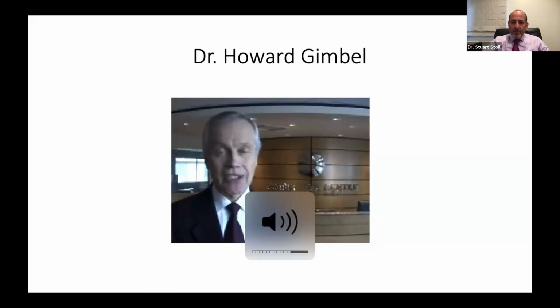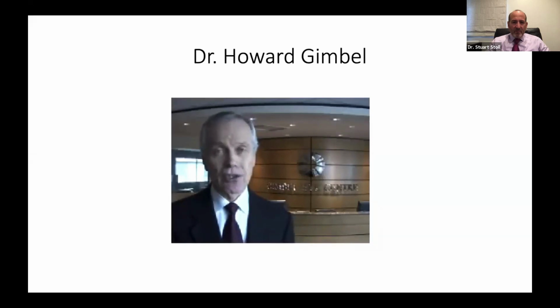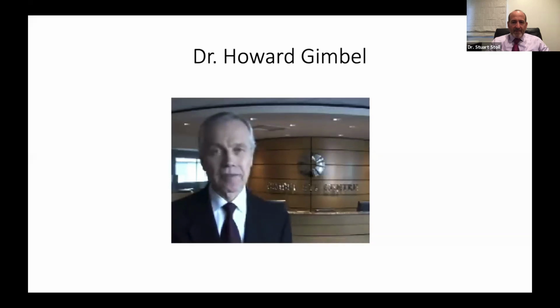Hello, I'm Dr. Howard Gimbel. I'd like to speak to you about an important teaching aid to help master the technique of continuous curvilinear capsulorhexis. I'm pleased that the CCC technique has become integral to modern cataract surgery. The teaching model, developed by Dr. Stoll and his colleagues, is a simple yet effective method to help master this crucial step in cataract surgery. I would encourage all of you that desire greater proficiency in the OR to utilize this tool to become more confident and effective cataract surgeons.